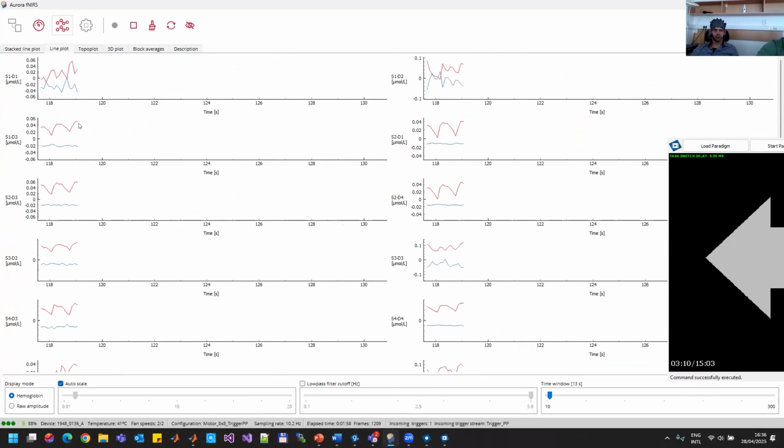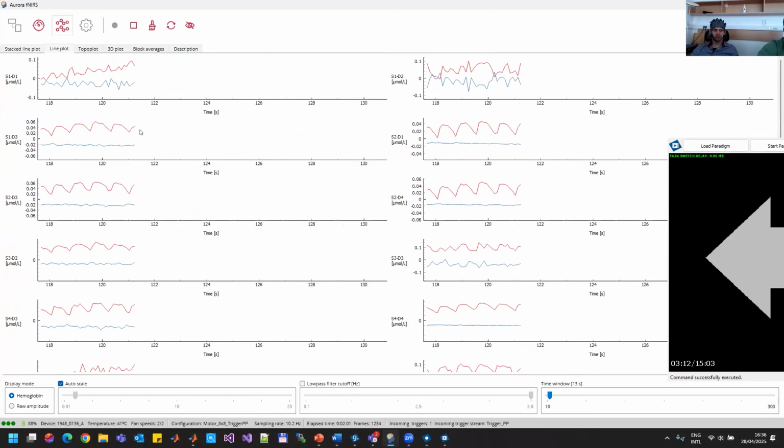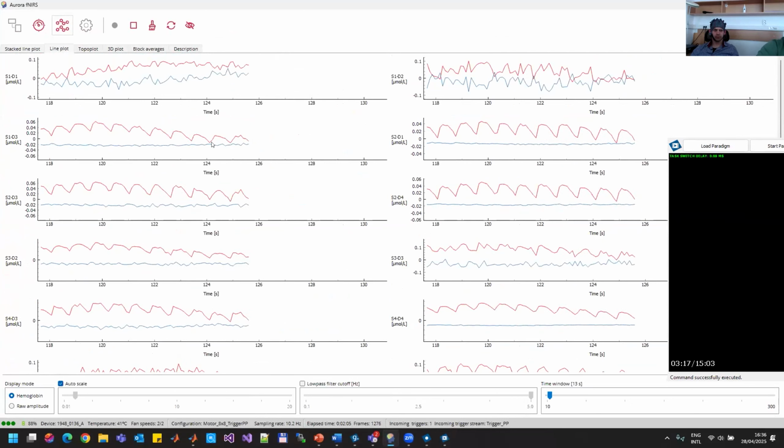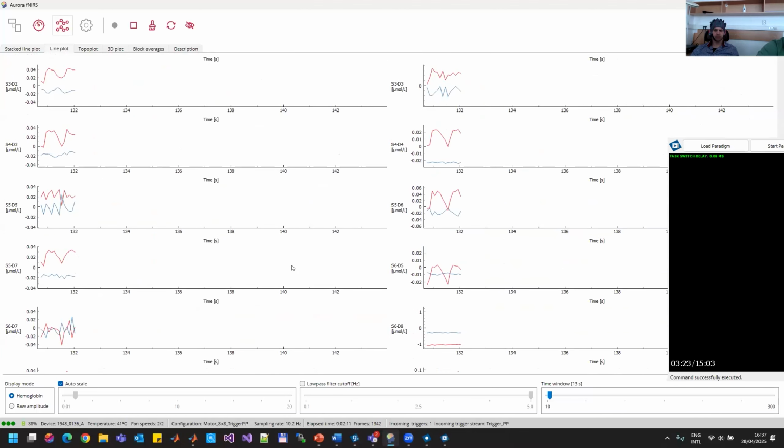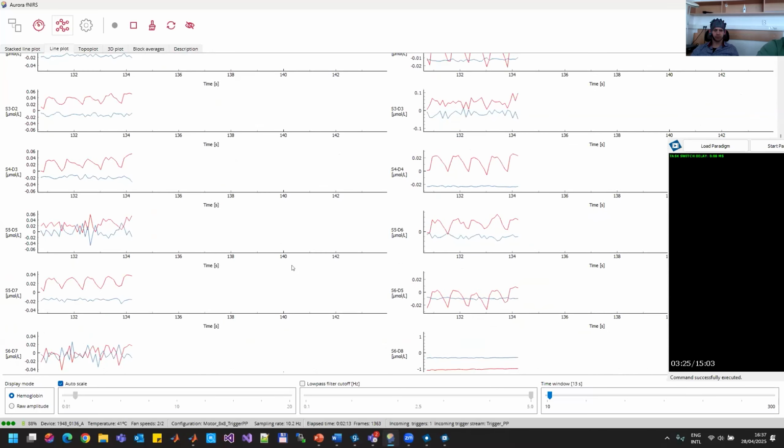What you see in here, these oscillations in HBO, basically it's the ECG, it's the heart rate. So it's very nicely seen. This means that the signal is good. As I told you earlier, it's a very good signal indicator. Okay.